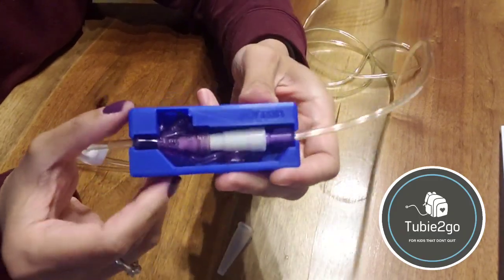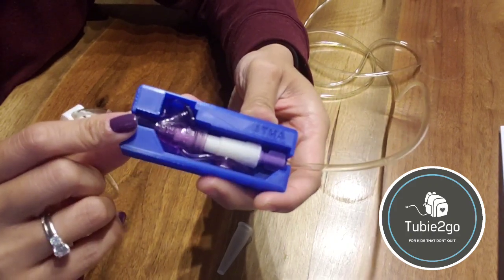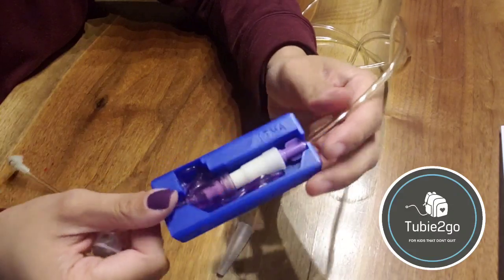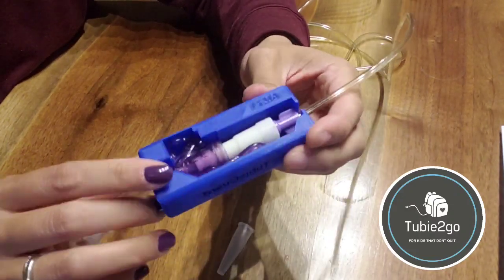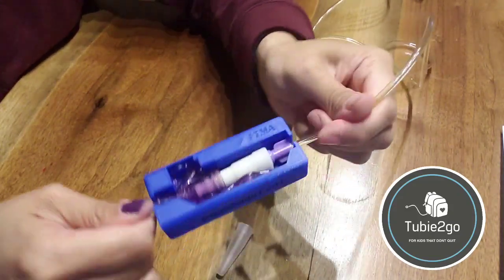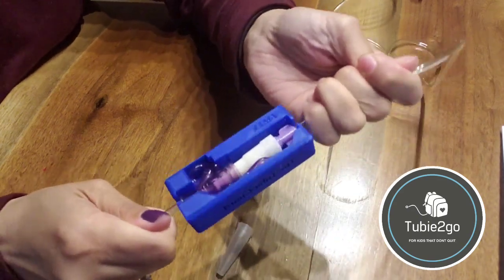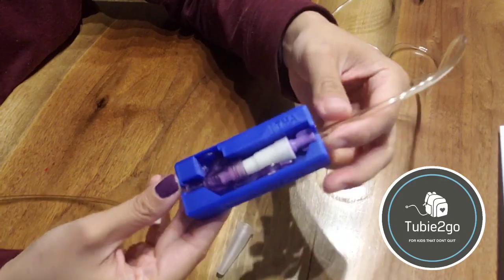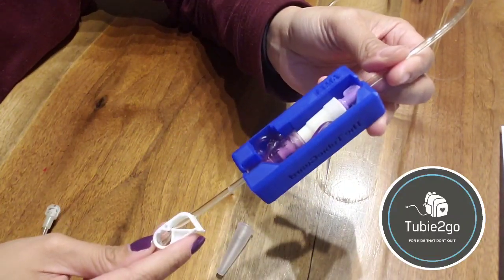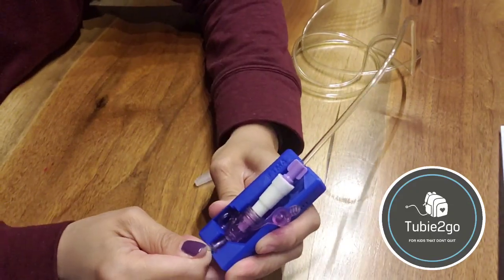You might hear a couple clicks, and you can see that the med port is very secured into that little slot, so it's not going to pop open the cap on the med port and accidentally feed the bed through there. And because of the snug fit, it's not going to pop out of this Tubieguard. So this will help prevent feeding the bed, just because it's secured in there. And much like the ENFit solution, I just don't see a way that it's going to accidentally disconnect through pressure or from some tugging motion. You really have to pry it out, especially this end here with the plastic.